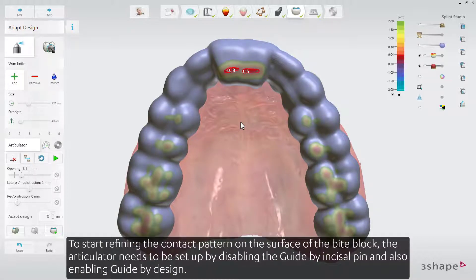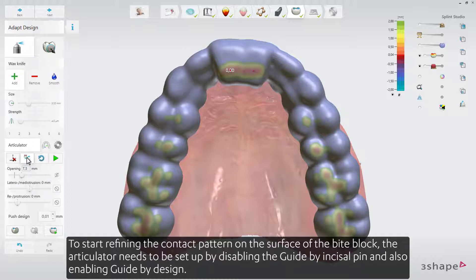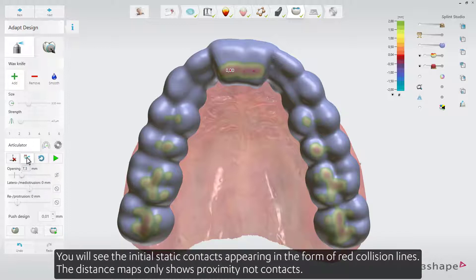This results in a geometry that is easier to polish and facilitates hygiene maintenance. To start refining the contact pattern on the surface of the bite block, the articulator needs to be set up by disabling Guide by Incisal Pin and enabling Guide by Design. You will then see the initial static contacts appearing as red collision lines.